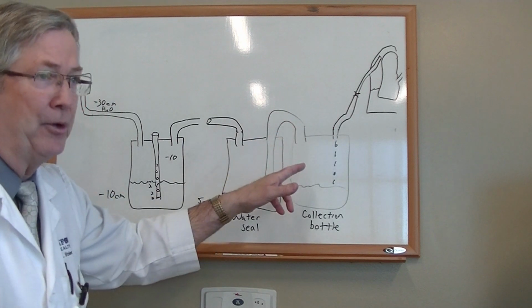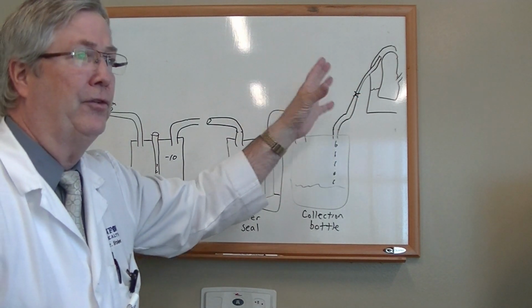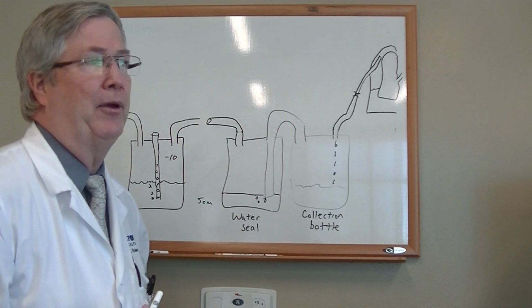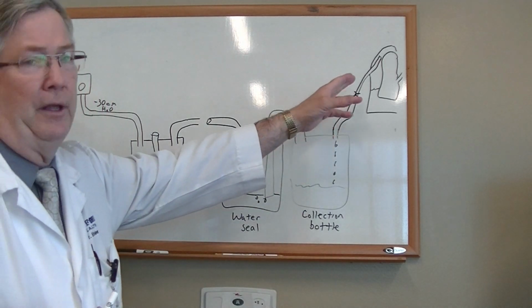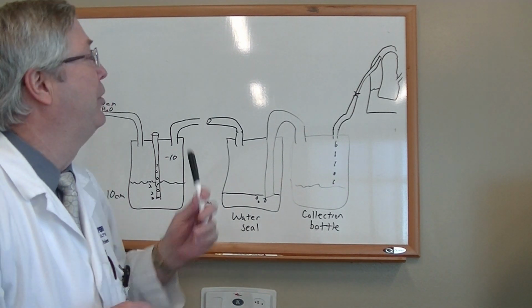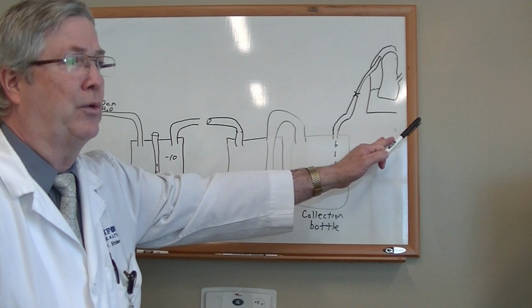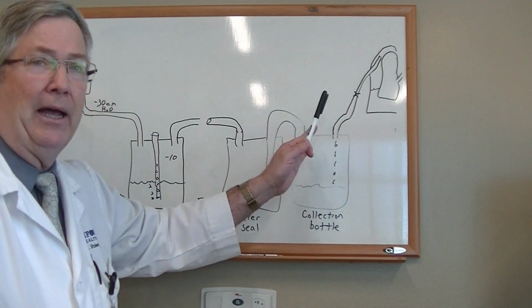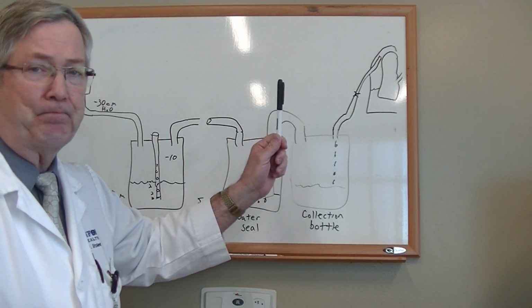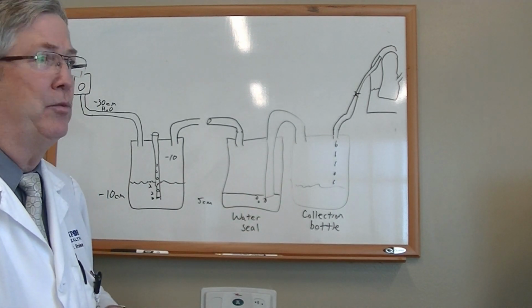Now, when we clamp a chest tube, we mean that it's not going to do its job at all. And if the lung can still stay up when the chest tube is not doing its job, then we know it's safe to pull the chest tube out. Normally, for nursing purposes, you're going to see an order to clamp the chest tube. They'll go off to x-ray, get the x-ray, and then when they come back, you can unclamp it because we already have the x-ray, so we know we have the information we need.